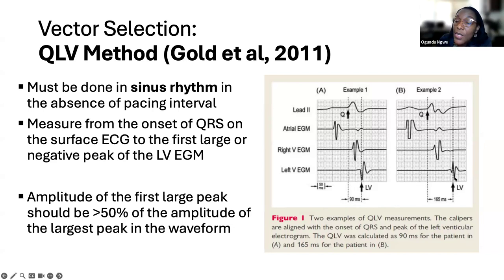So it tells you that you are using a pole that is in an area of extremely late activation. And this is a very important measurement that translates to improved clinical heart failure symptoms, whether it's reducing MR, reducing mortality, decreasing LA size, or decreasing hospitalization. It's another surrogate of how good your LV lead placement is. Next slide.